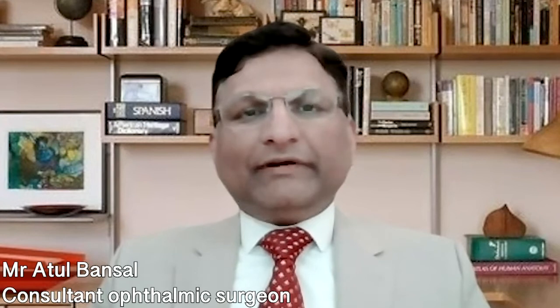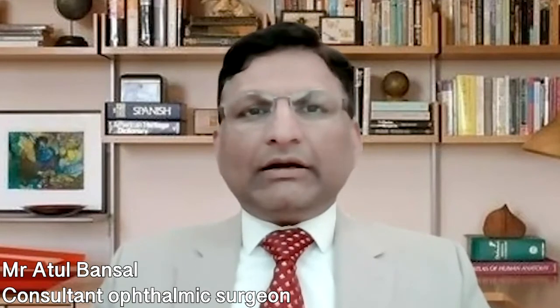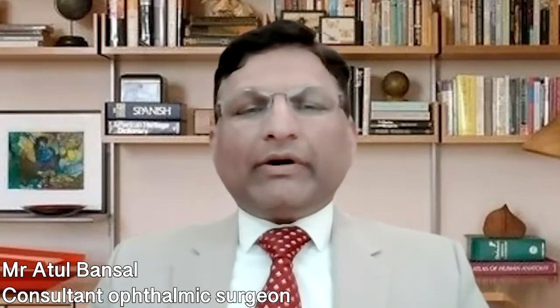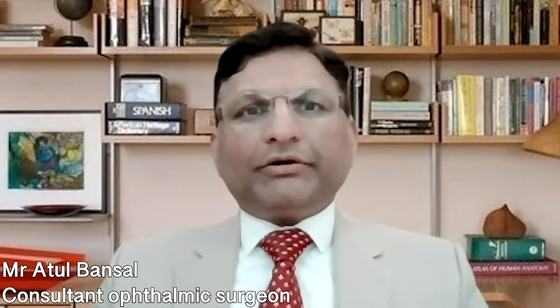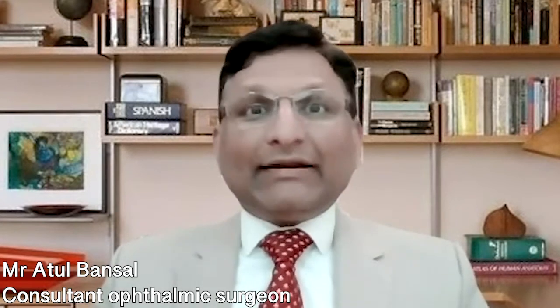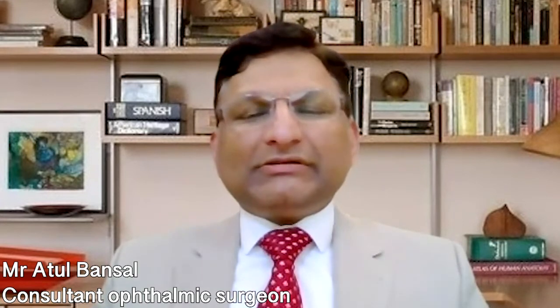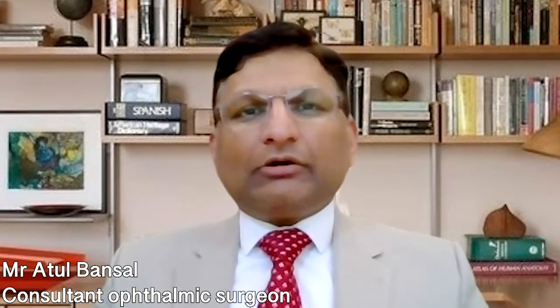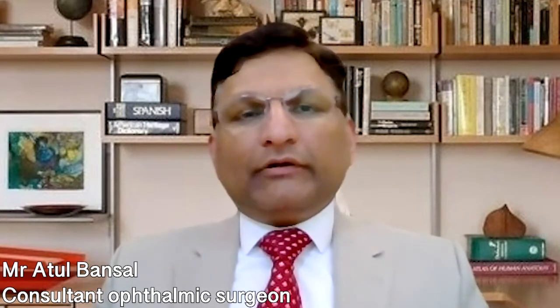All three types of laser that I have mentioned work differently, but they all are done in a painless manner. Different types of lasers require different drops or medication to control the pain, to prevent any pain during surgery. Selective laser trabeculoplasty is done as an outpatient procedure with just numbing drops, and no further anesthetic is required, and patients are quite comfortable during the procedure.